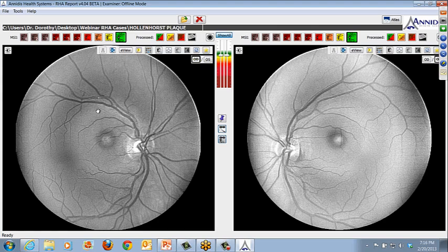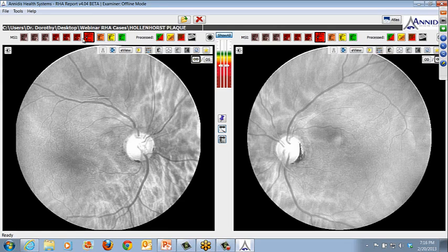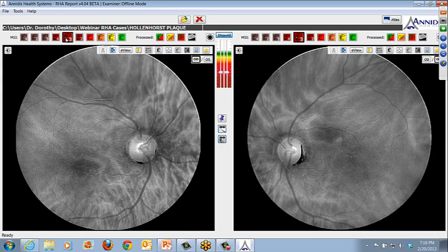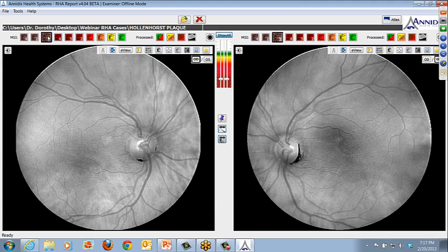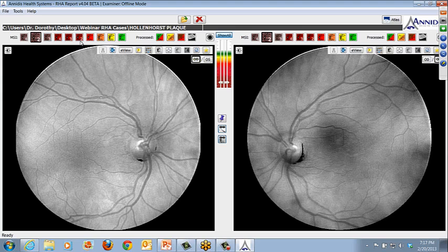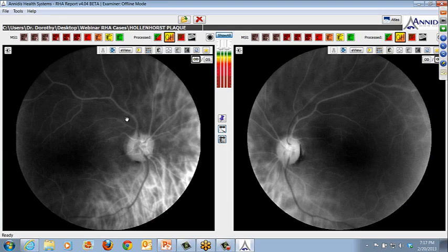In this case, because you're using the low light LEDs, you can actually very nicely see that plaque sitting right in the center of the vessel. And you certainly know it's in the vessel. As you go past, it will fade. You'll see it, though, all the way down through. It's hyperreflective. It's a highly condensed cholesterol plaque, and so it will persist through the other images and finally start to fade here. In this case, you can also see that this is non-occlusive. So this is a non-occlusive atheroma, if you will, which is what Hollenhorst plaques are.